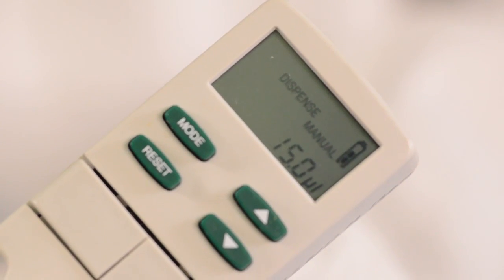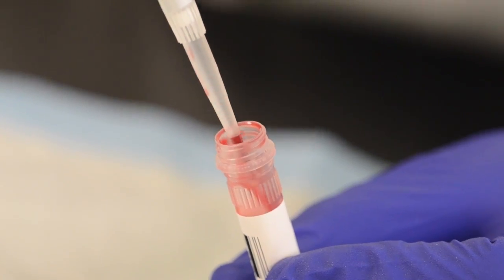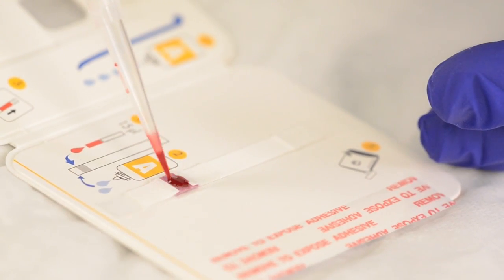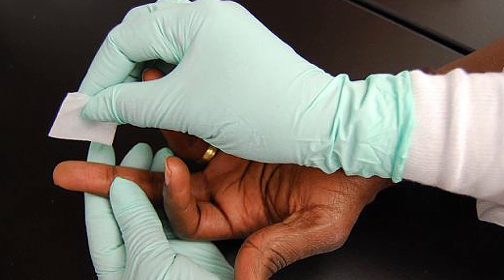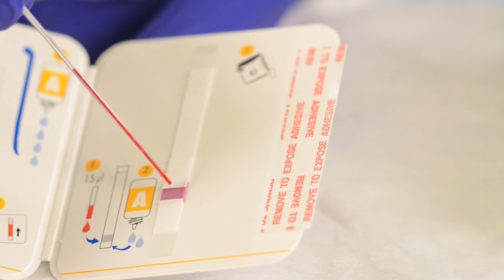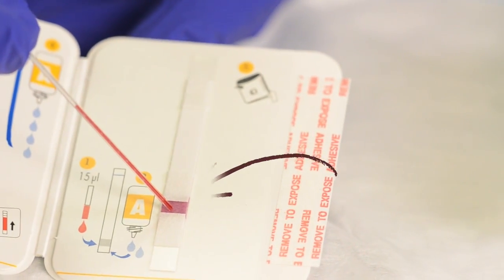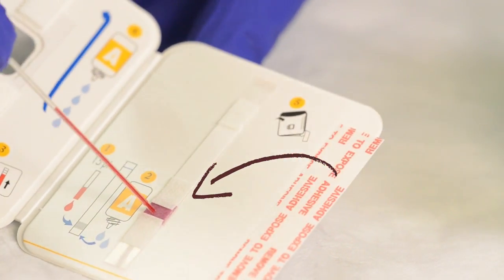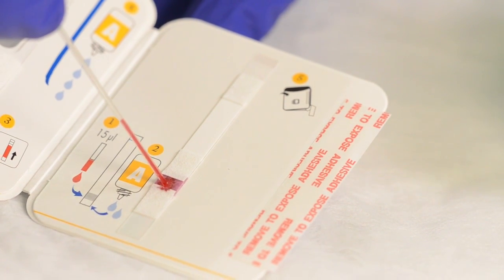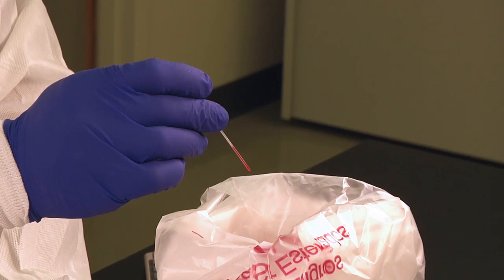If you are using a venous blood specimen, slowly add 15 microliters of blood to the bottom half of the purple sample pad. If you are using a capillary blood specimen, slowly apply blood from the capillary tube to cover the entire purple sample pad on the right side of the device. Once the pad is saturated, discard the capillary tube into a biohazard sharps waste container.